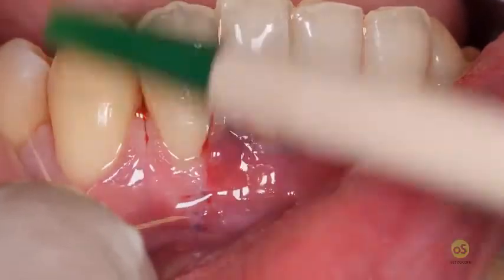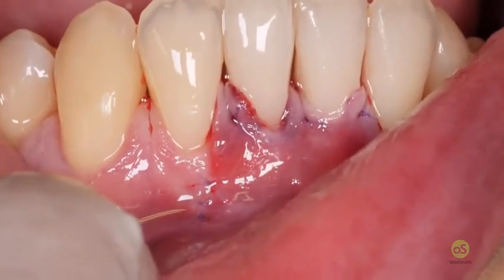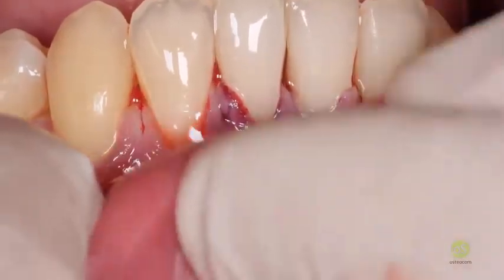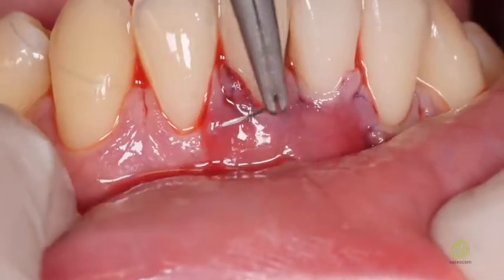Now we can go coronal, and as much as we go coronal, the assistant should reduce the tension, so you should only see here at the level of the papilla area here.